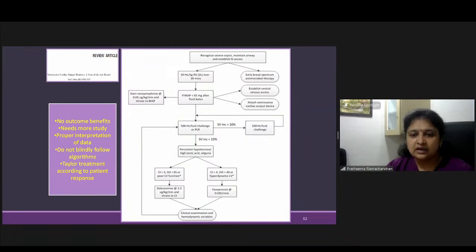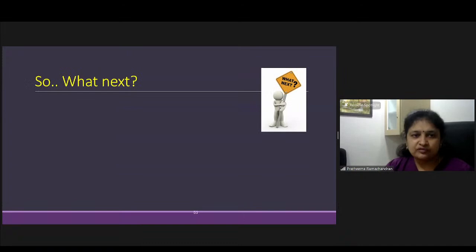And intensivists, by their personal choice, are looking into at least minimally invasive cardiac monitoring. They are not totally, it is not like putting it on autopilot mode, thinking that non-invasive is good. But in OTs, where the patient is going for a high-risk surgery and is not very sick preoperatively, the surgeons are very happy if the anesthetists use the non-invasive methods. So what next? We have all these things, invasive and non-invasive, put together. So what next? There are many modalities available which are non-invasive or minimally invasive.